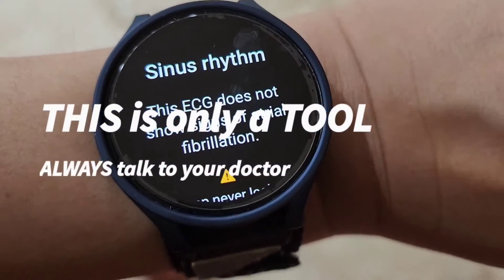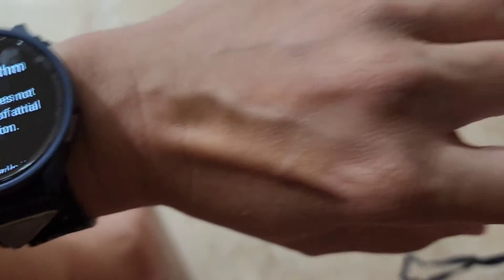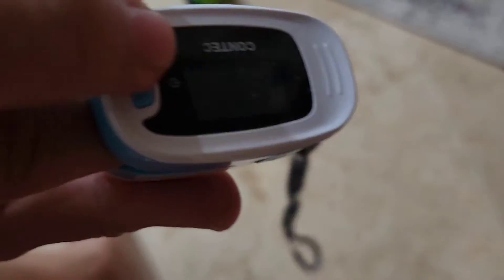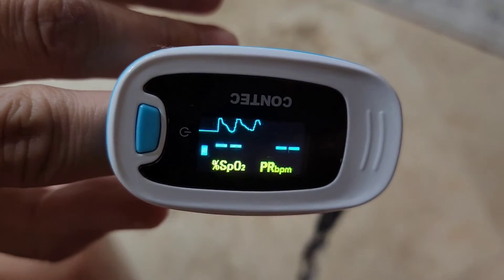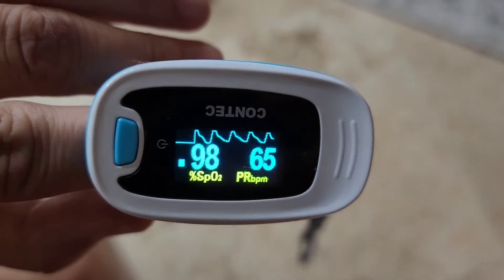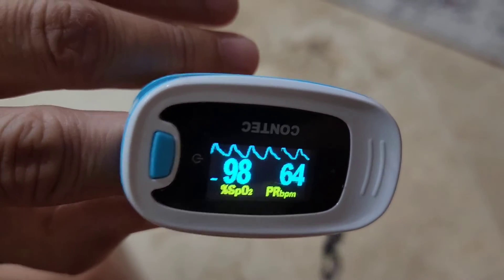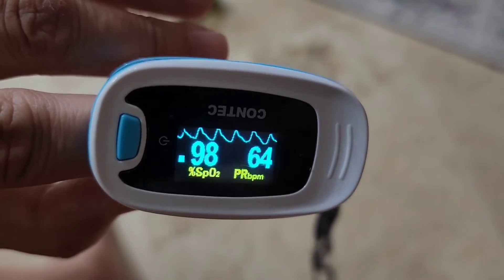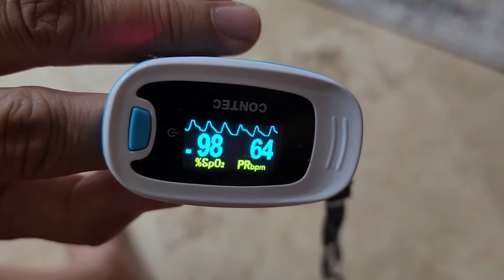If you don't have a sport watch or can't afford one, I have something pretty affordable that'll do similar things — not exactly, but similar. This is a pulse oximeter that I got from Amazon. Just FYI, I'm not a medical doctor and I'm not in the medical field — this is just my own personal observation.